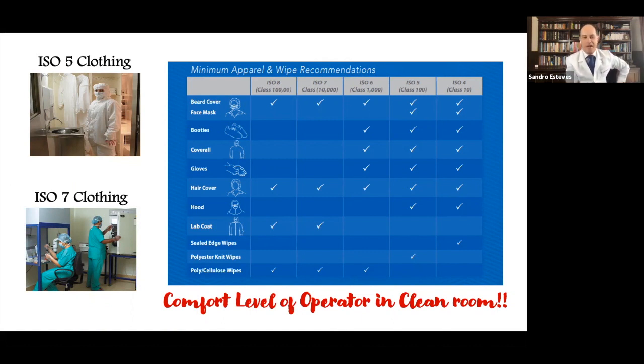So in our lab, working for more than 18 years in the situation that you see in the upper part of this slide, this is the way our embryologists have to go. This is like the precautionary principle. We don't have a lot of data in the literature concerning air quality control. Most of the publications that are available, including ours, are retrospective analyses or before and after renovation.